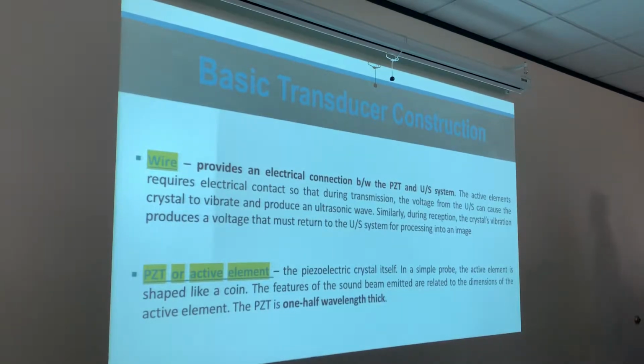So the PZT crystal itself, in simple terms, the active element, is shaped like a coin. Remember, we're talking about a single element transducer right now. We're not talking about what we use every day. We're just talking about a single element transducer. I've never seen one myself, okay?